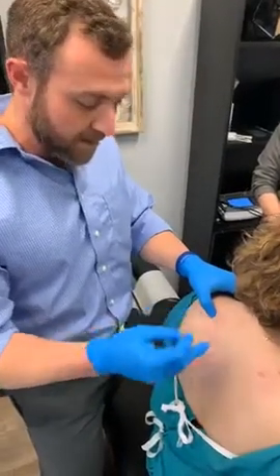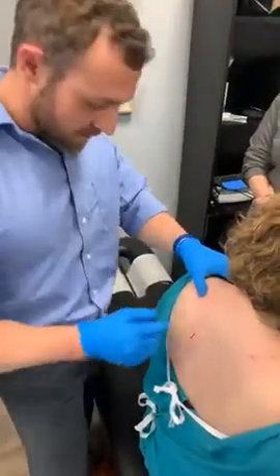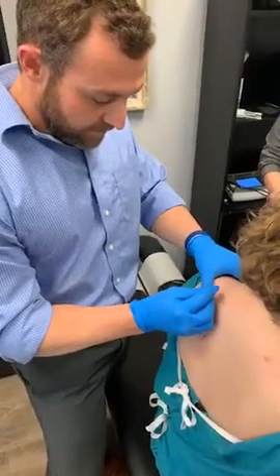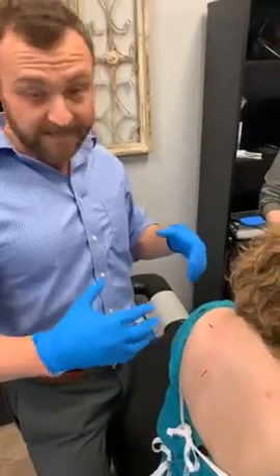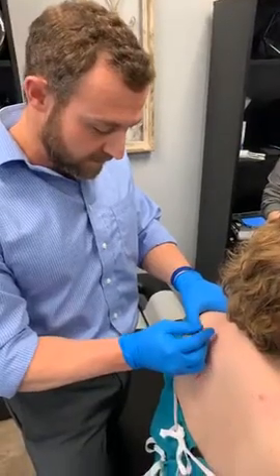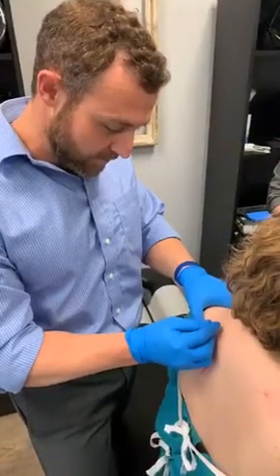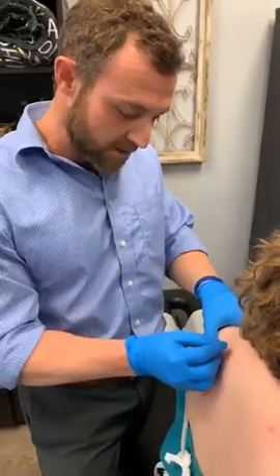We're right in the traps, which are a really easy, common place we see trigger points develop, because these are our postural muscles. These are what give us problems when we're sitting at a desk too long or we're on a computer too much. So Lindsay, you just tell me when you feel a little bit of pressure. Yeah. She should feel the pressure right about now, because I can feel this needle right in the knot.